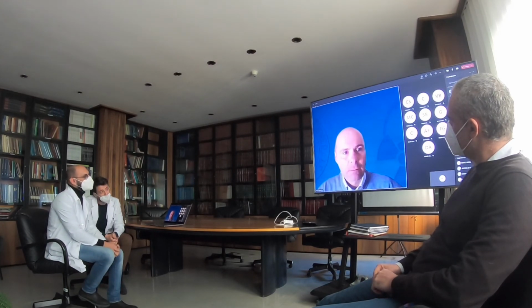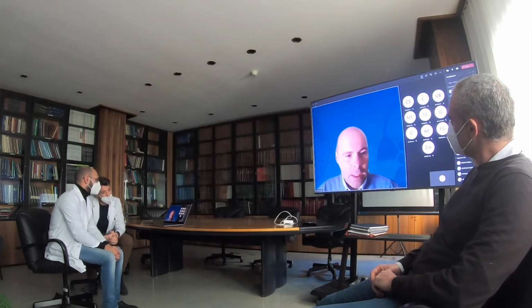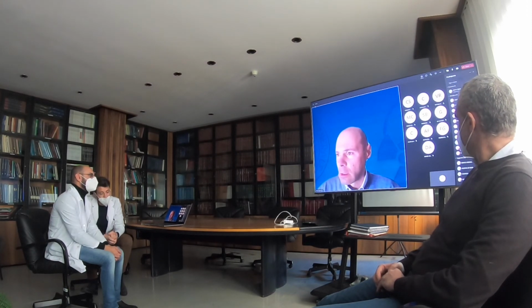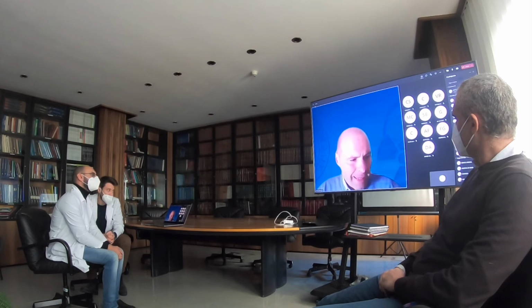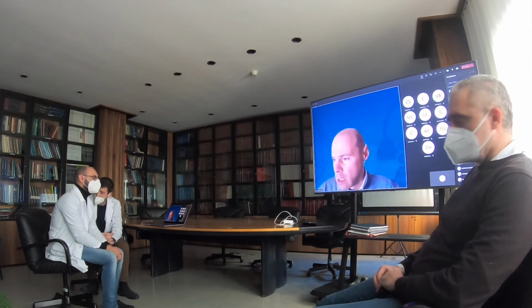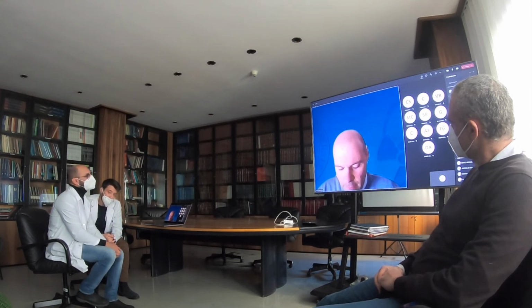First of all, the importance of intestinal preparation for the good quality of the MR examination is mandatory: to perform a rectal enema in order to eliminate all the residual stool, and so make the endometriotic foci more hyperintense on T1-weighted sequences. And this is mandatory for the good quality of the MR examination.